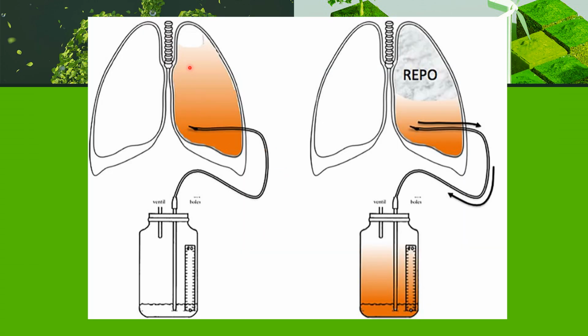Here you can see another demonstration. So this is the aspiration, and the chest tube was inserted. Once the chest tube is inserted, if the whole of the fluid is evacuated at the same time, re-expansion pulmonary edema can happen. So what is the caution here? During aspiration, once you see the fluid coming rapidly into the bottle, then you clamp the tube.